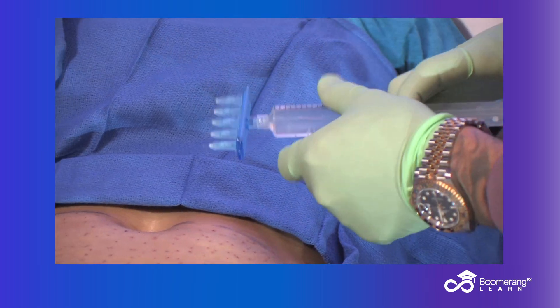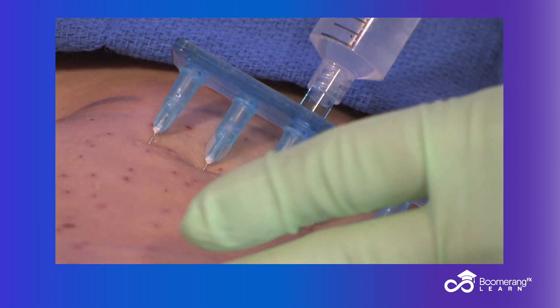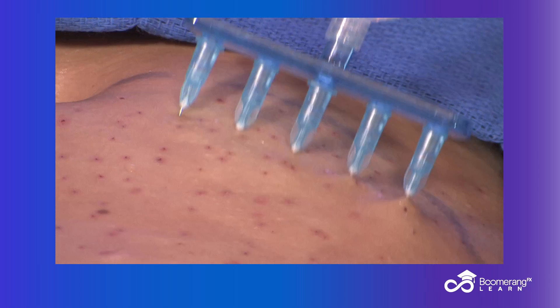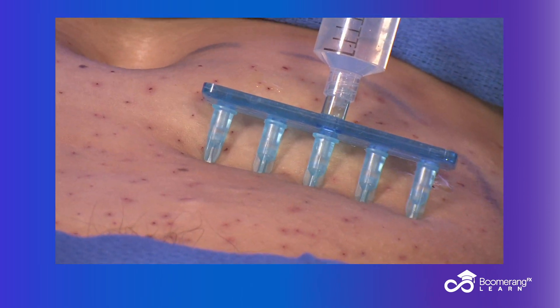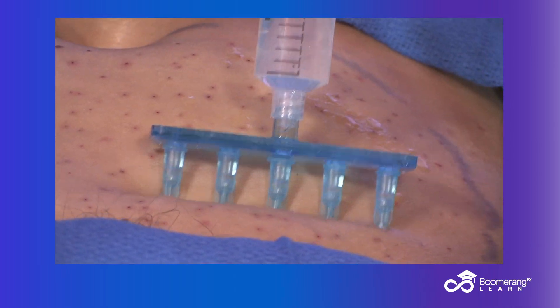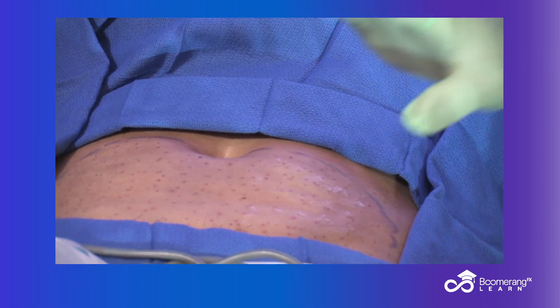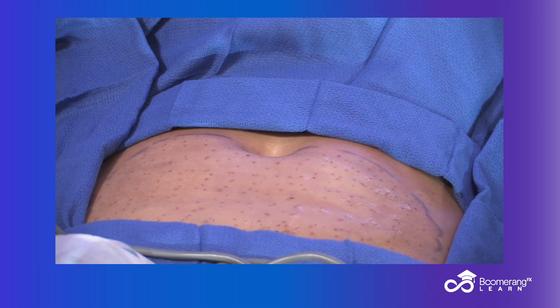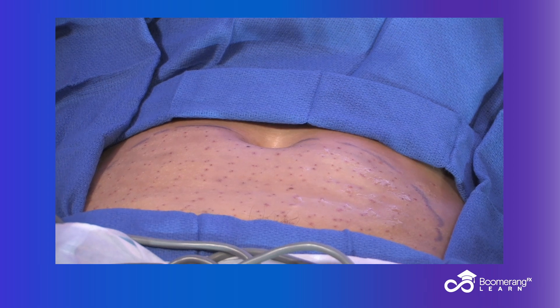So I'm going to give you a few sticks here. Are you ready? One, two, three big sticks. You really just go like this and then just infiltrate the area. Another stick — infiltrate the area. This is the worst part of it. You can see she's huffing on some Pronox to make it more tolerable. In terms of how much volume — because that's going to be your next question — how much per area is really purely for patient comfort. I'm not trying to mess it up. This is not BodyTite, I'm not doing lipo. So it's really just for her comfort. You put in enough to make the patient comfortable.